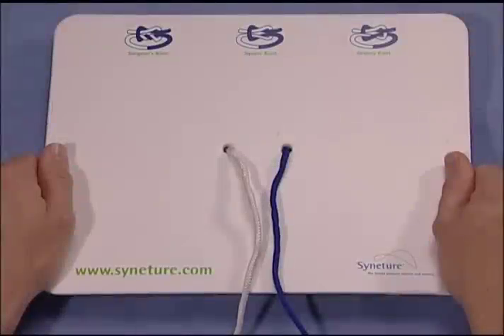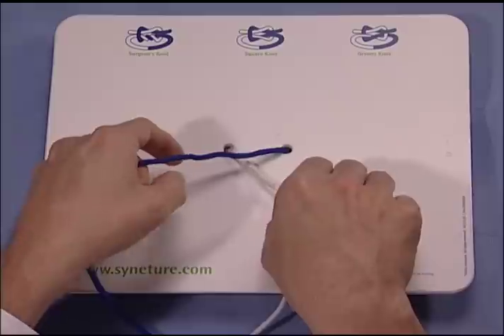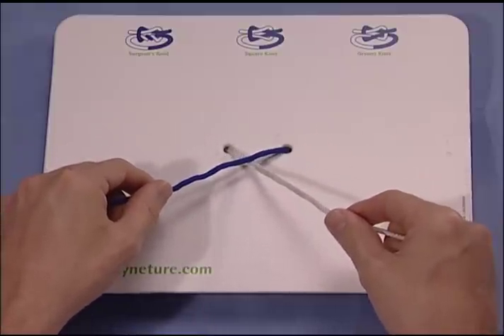A surgeon's knot is a variation of a typical square knot. The knot begins the same, again leading with the forefinger.